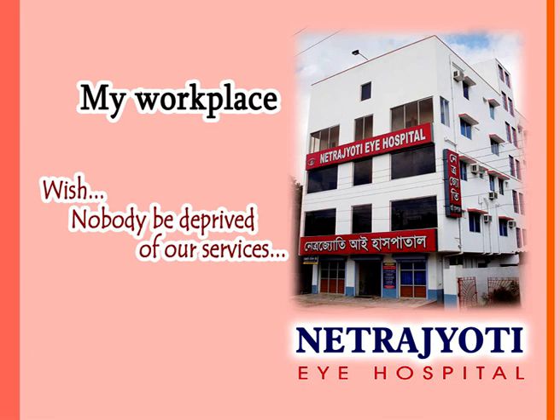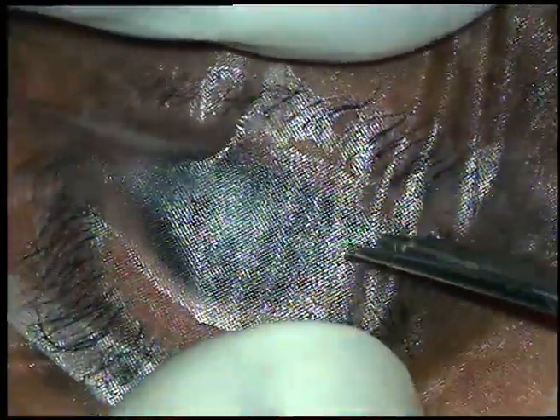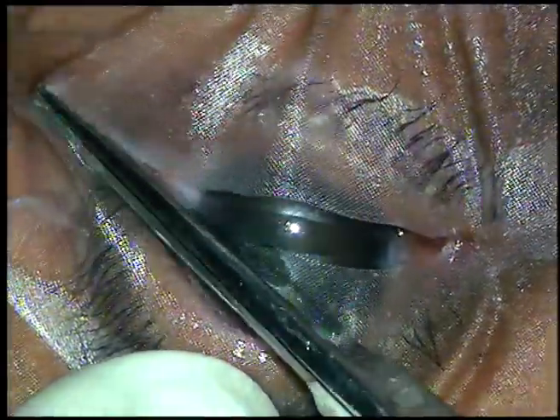Friends, welcome to my workplace at Rana Ghat, West Bengal, India. In this video, I want to demonstrate intravitreal injection of bevacizumab or ranibizumab.